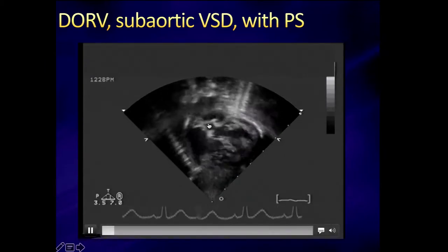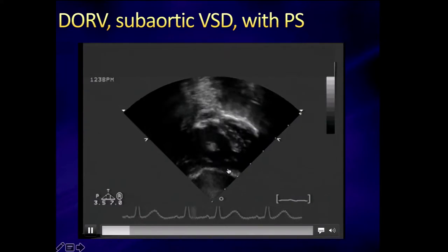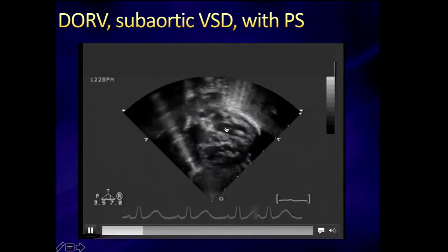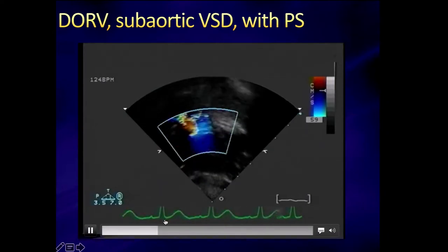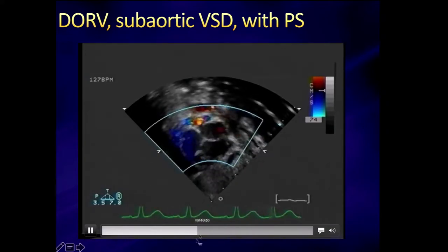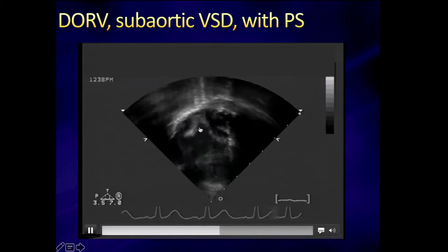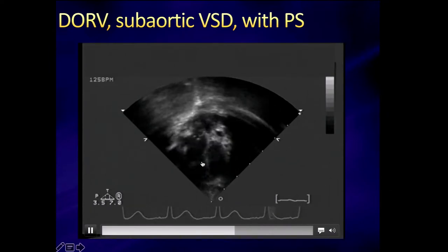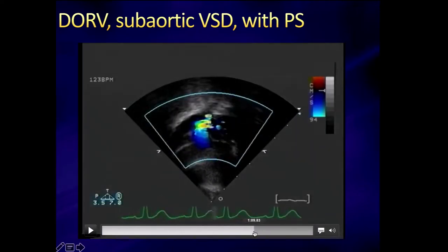On echo from a subxiphoid view, here's the VSD and the aortic valve. As we scan anteriorly, you can barely even see the pulmonary outflow tract. With a little bit of conal septum here, you can see that the aorta is completely over the right ventricle — it's quite anterior, both the aorta and the pulmonary artery. There's a subpulmonary area here. Here's the VSD, the subpulmonary area, and the pulmonary valve. You can really see that both great arteries come off the right ventricle. This looks like a tetralogy of Fallot — it's a matter of degree, with the aorta completely off the right ventricle.